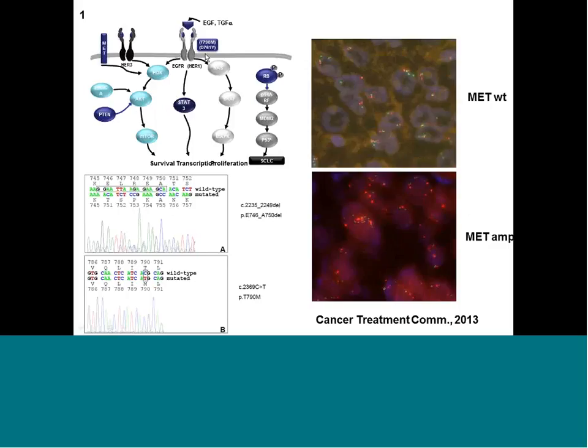And then this was blocked by the second generation inhibitor and the antibody, and then she developed an amplification of this rescue receptor, MET, that signals into the EGFR receptor pathway and restores again the EGFR dependency. And you can see in the third biopsy, in the red signals, this massive amplification in c-MET, which was not present in the previous biopsy where only the T790M resistance mutation was present.